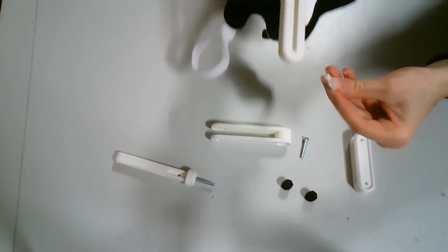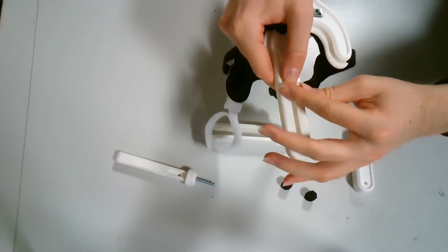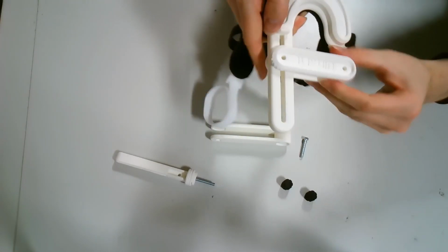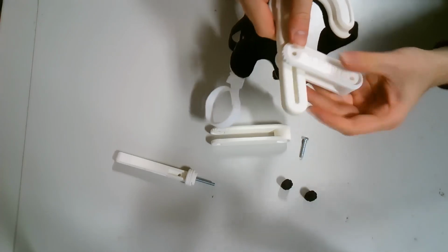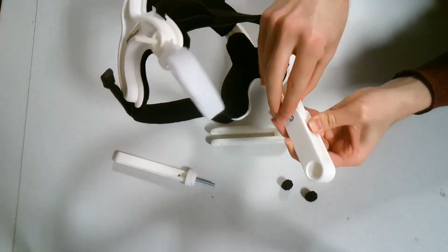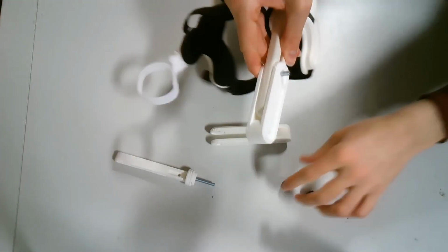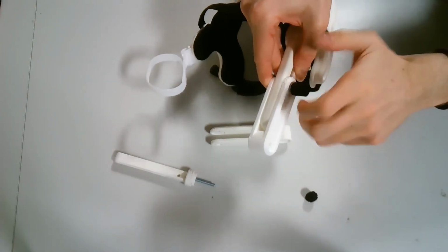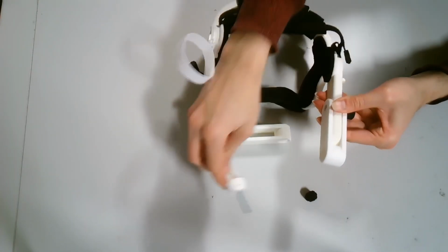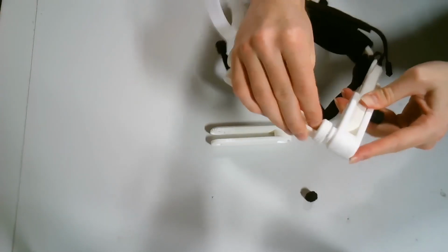Keep the washer together with it and ensure the arrow on the washer points up. Slide the new side arm on. Attach it to the headset using the bolt and the knob. Attach the front arm to the side arm and secure it with the knob.